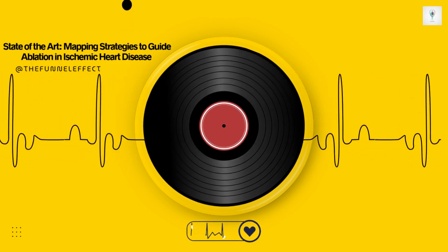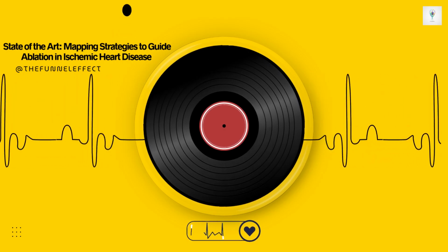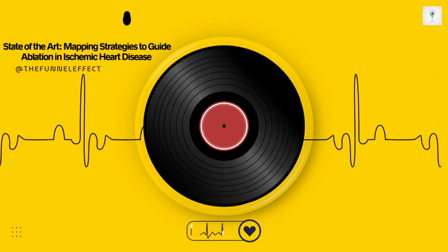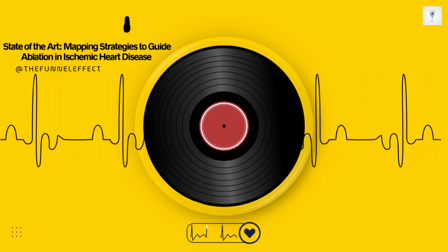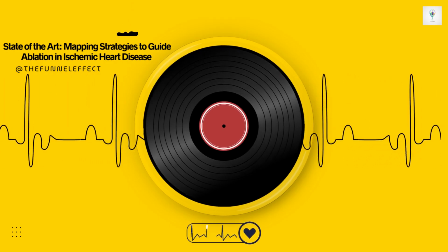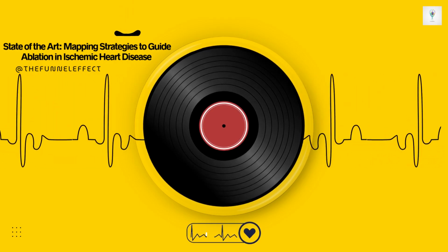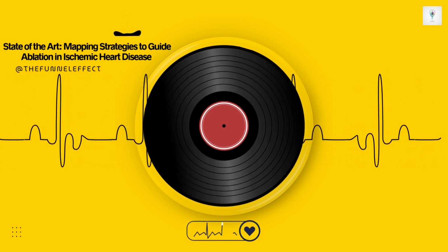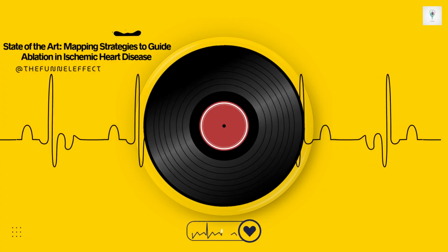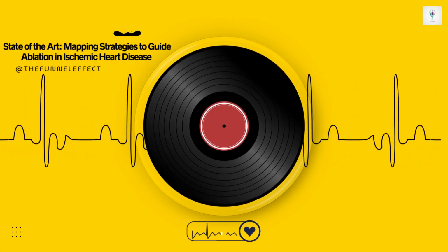It sounds almost foolproof when you find ECF, but the review mentions pitfalls. What can go wrong with entrainment? Several things. First, technically, you have to pace gently. Use the lowest energy output that reliably captures, usually starting low, maybe 10 mA. And you need to time the pacing carefully, often starting in late diastole. Pacing too aggressively can actually terminate the VT, which sounds good, but then you lose your chance to map it completely. Or it could accelerate the VT into something faster and more dangerous.